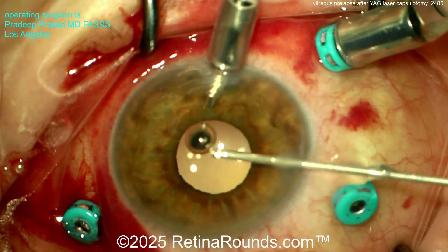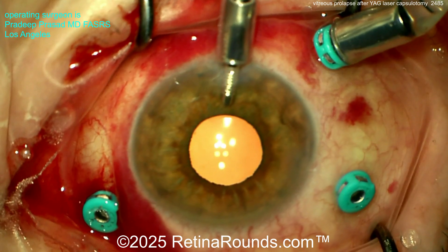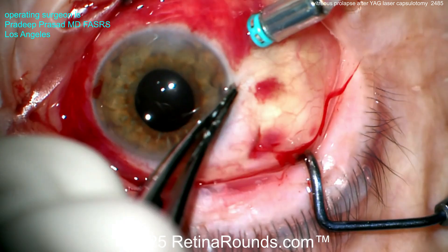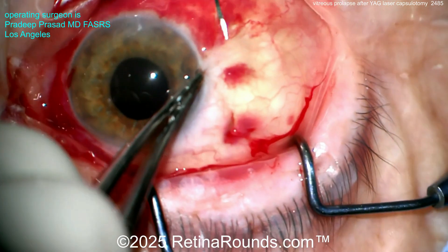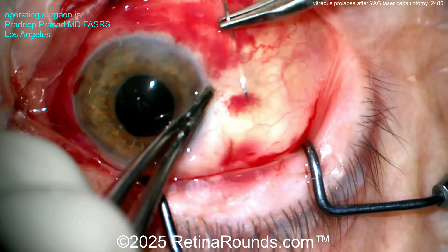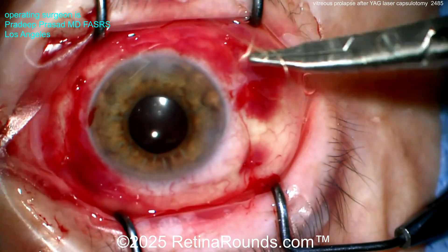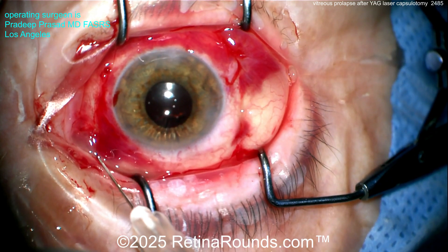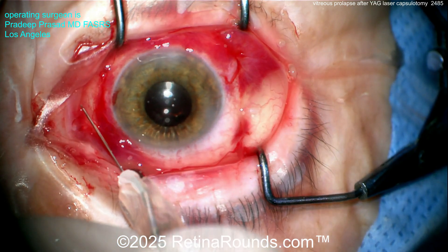Next, we're going to put some Miochol in the anterior chamber to constrict the pupil. If we see any peaking, be very suspicious that there may still be some vitreous there. We can see that the pupil looks nice and round, so that really completes the case. We're going to close up our sclerotomies using 6-0 plain gut suture, and then inject a little bit of antibiotic and some steroid. This patient did really well and was very happy with her outcome.